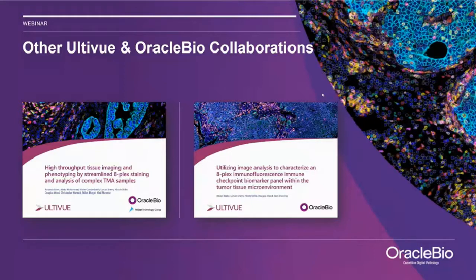So we want to really avoid introducing additional biases by just selecting region of interest. And then, of course, afterwards, you can still use this entire image to annotate the tumor or the stroma, like Lorcan has shared in his presentation. And in addition to that, Lorcan also mentioned that we can perform H&E on the same exact slide where we have performed the multiplex IHC, and this also helps pathologists to annotate the samples for the analysis afterwards.